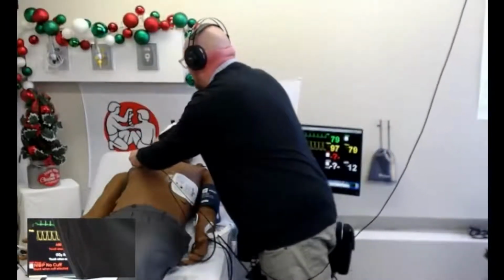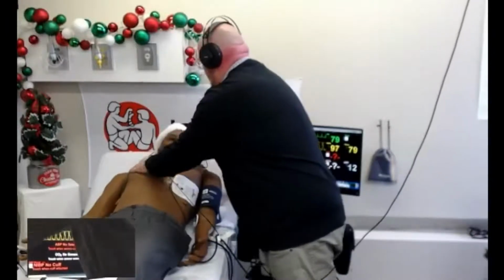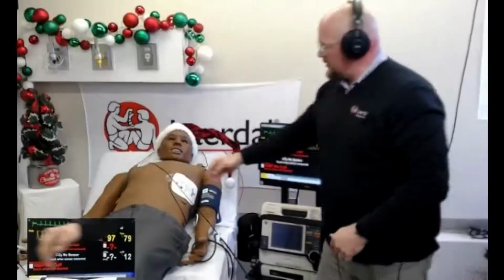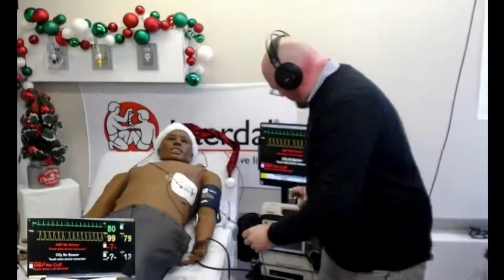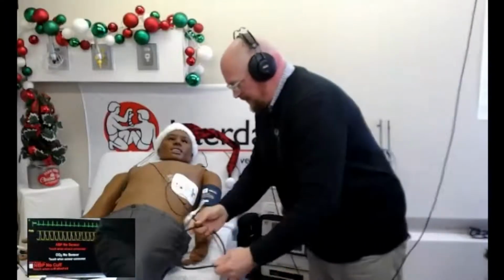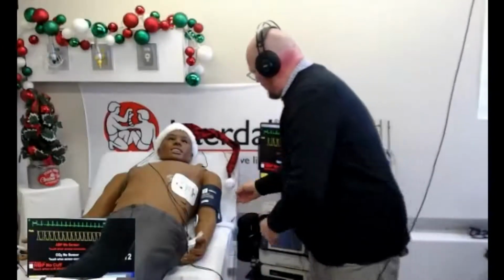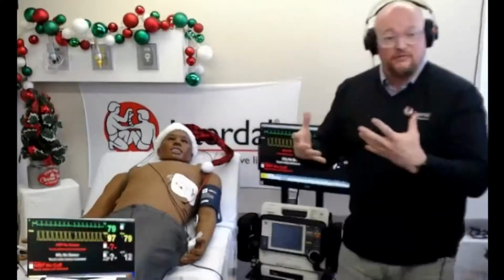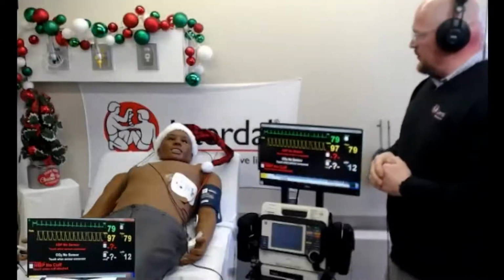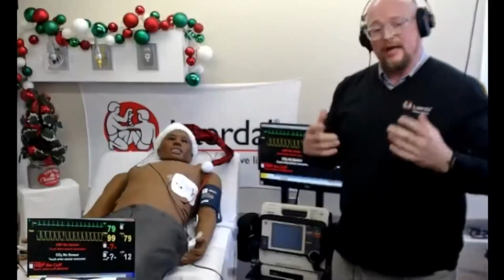So I'm just taking my new pads and applying them. There you go. Actually, I could have moved that one down a little bit, but I think that's good. All right, so that's all nicely sticking to that dressing. The new pads are on and plugged into my defibrillator. I also have my 3-lead ECG hooked up as well, so then we can also look at some of the pacing features that we're going to be able to do. Great. I think someone in the chat was asking about pacing and cardioversion. So yeah, we're going to get right into that.